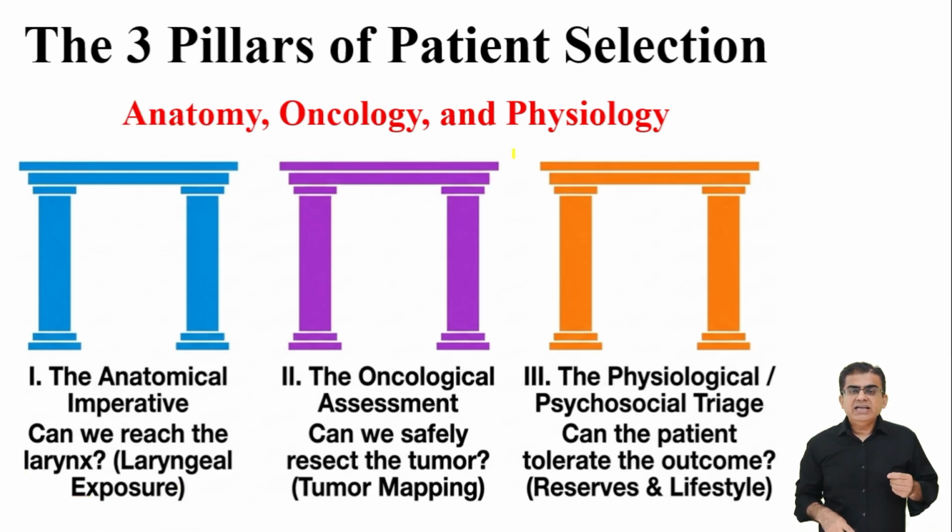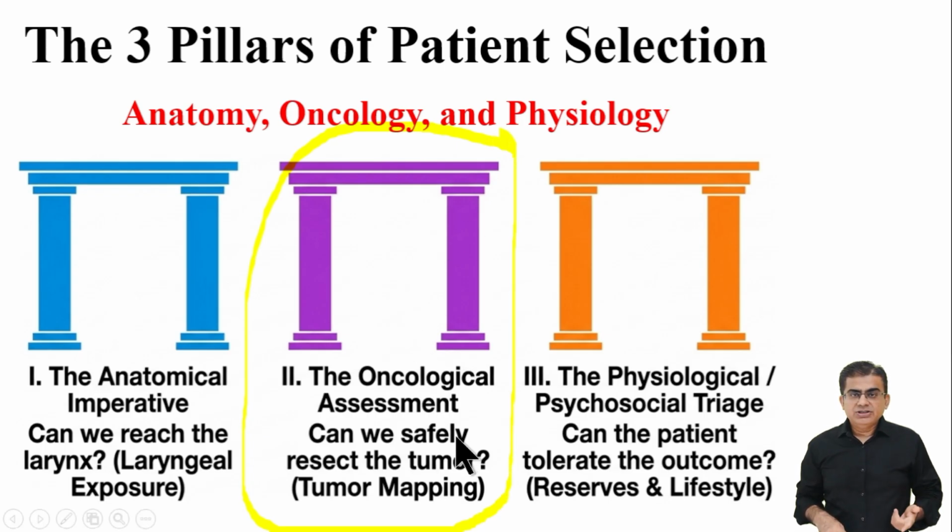Second is the oncological assessment. This asks our second question. Can we safely remove the complete tumor? We must carefully map out the exact boundaries of the cancer. We must make sure the tumor is not hiding in deep, dangerous spaces.